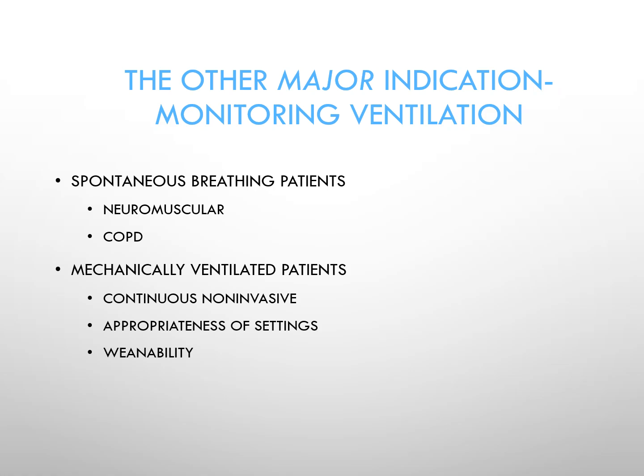So as their muscles get weaker, the CO2 will tend to build up and be able to be measured with capnography. With mechanically ventilated patients, looking at continuous non-invasive ventilation, it can actually measure the adequacy of the non-invasive augmentation that we're providing the patients.